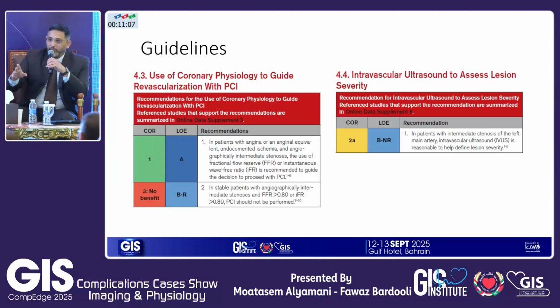So the other thing is we can play devil's advocate here. There are 2 tandem lesions as you suggested, right? And if you do an FFR, how will you know that the left main is significant or not? So you can't really judge on the FFR. And will you do FFR or iFR?